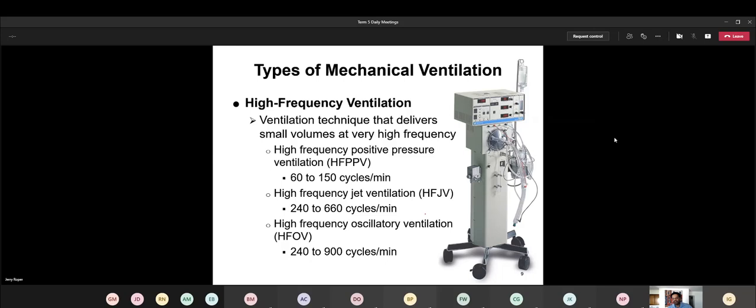At least my first job when I was in LA, we used to rent these machines. So that way, when we talked about high frequency, then we could use them, and you could set them up, and you can go through that whole process of calibration. No one really remembers the calibration process.